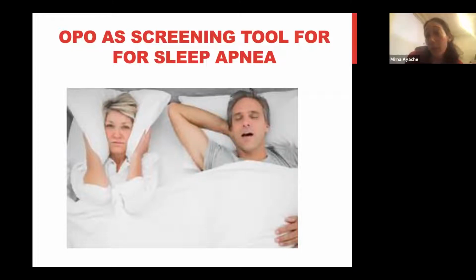Some people think that it's very useless actually. And one of the reasons is because you can get a PSG, which is basically harmless, and so that has higher accuracy. And the question is, why would you get an overnight pulse oximetry if you can get a sleep study? I compare an overnight pulse oximetry, for example, to a stress test as a screening tool, and then getting a cath. But the difference is the cath is invasive, and so it makes perfect sense to start with a stress test. But since both overnight pulse oximetry and a sleep study are pretty non-invasive and pretty easy to use, some people may think, why even bother with the overnight pulse oximetry?